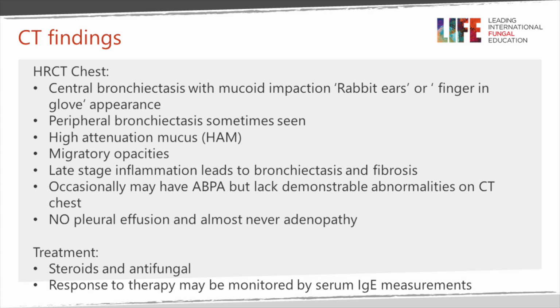Just sometimes, because it can be an intermittent allergic process, you may have ABPA, but you haven't got any CT findings, and you're then more reliant on the other two serological causes that I mentioned on the previous slide. It's not characteristic to have a pleural effusion, though sometimes you'll see a bit of fluid, and almost never will you find lymphadenopathy.